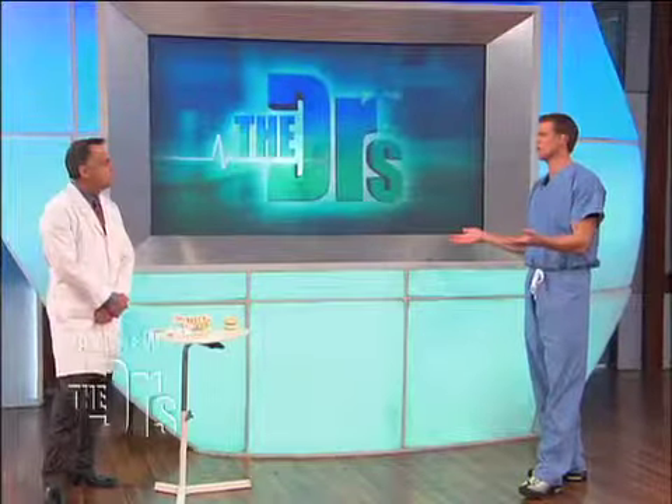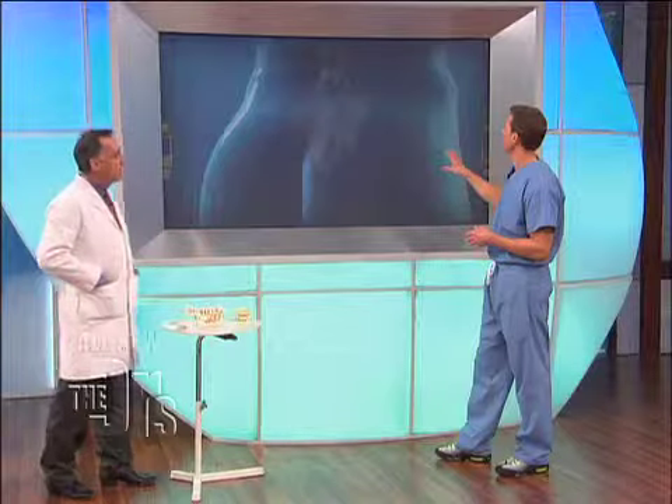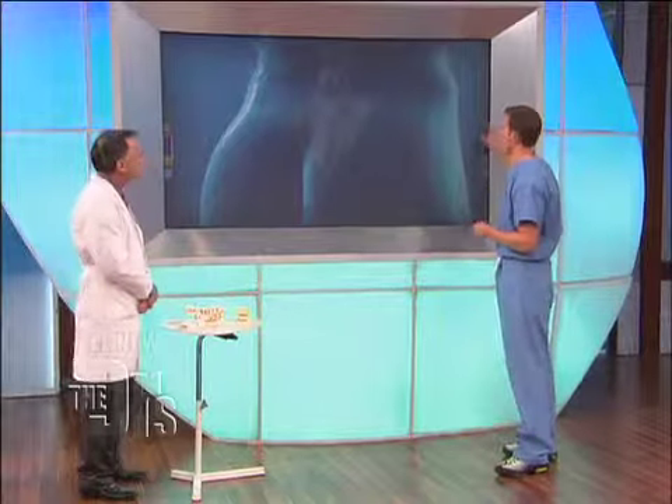So back pain is so very common. Obviously we hear about big surgeries, and sometimes big surgeries are needed, but you're here to talk about a new procedure. We're talking about the AcuraScope procedure today, which we feel to be a very exciting new procedure in medicine for back pain — specifically for the common thing we hear about, which is a slipped disc or herniated disc of the back. Let's walk through the animations up here of what exactly you're doing with the AcuraScope procedure.